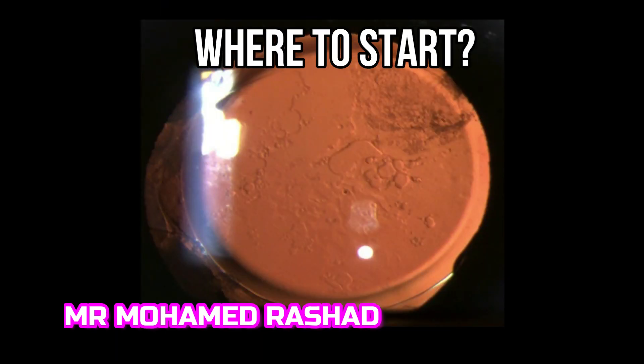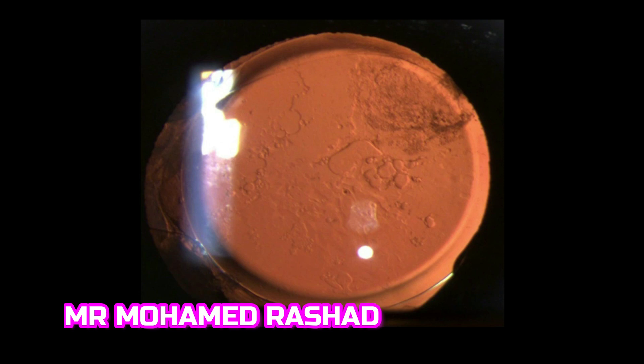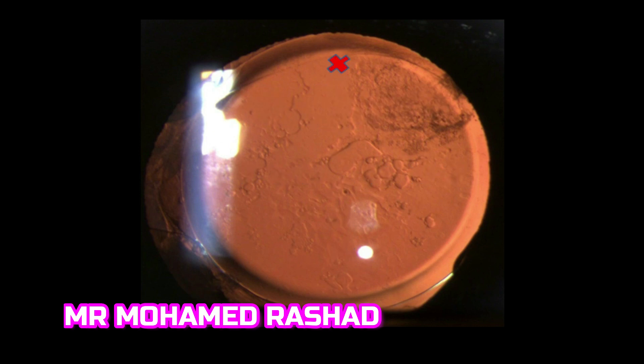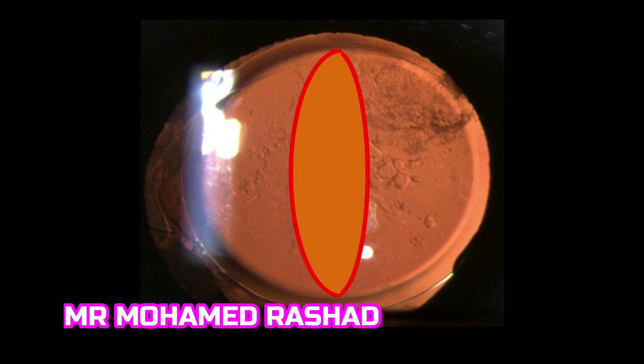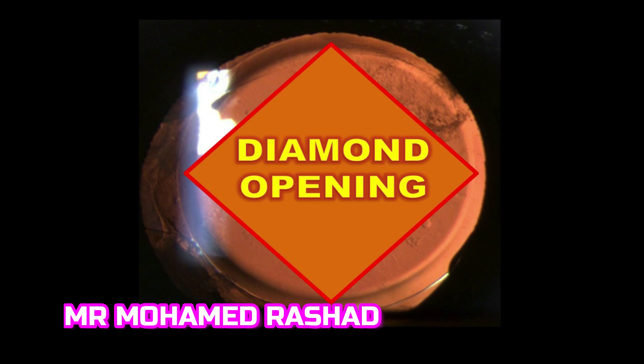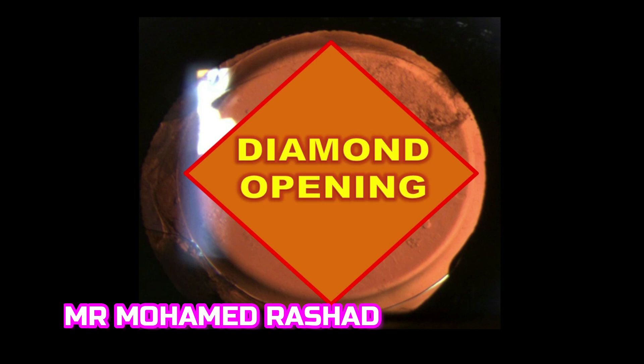In my opinion, the easiest way to make an opening in the posterior capsule is by doing a cruciate opening like this one. You start at 12 o'clock and go down, avoiding pitting of the intraocular lens, until six o'clock, creating an opening in the center. Then enlarge it on both sides from the center to the periphery, giving a diamond-shaped opening. This prevents flaps along the visual axis, unlike the circular technique.